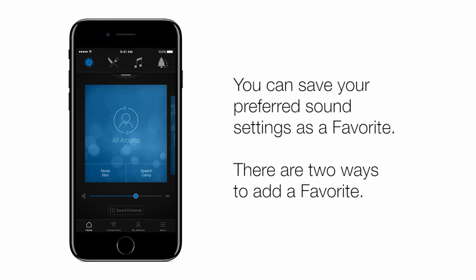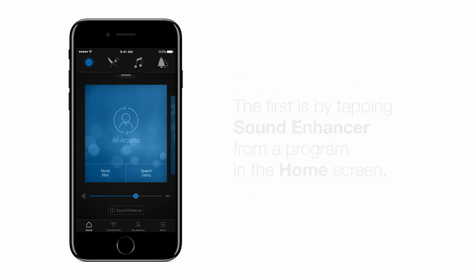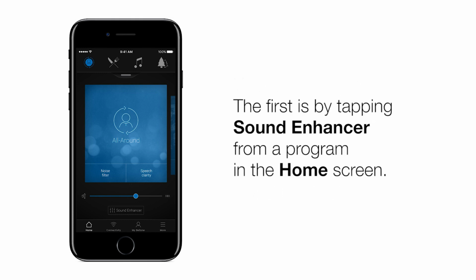You can save your preferred sound settings as a favorite. There are two ways to add a favorite from the home screen of the HearMax app. The first is by tapping Sound Enhancer from a program in the home screen. A finger points to the Sound Enhancer button below the volume bar.